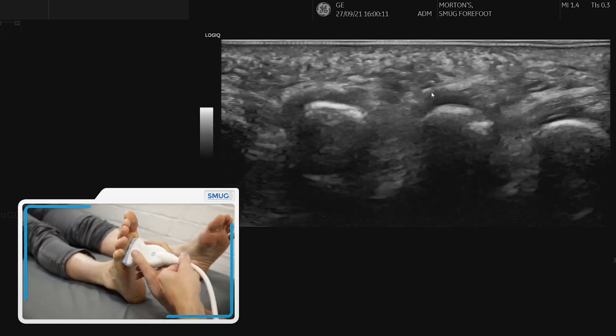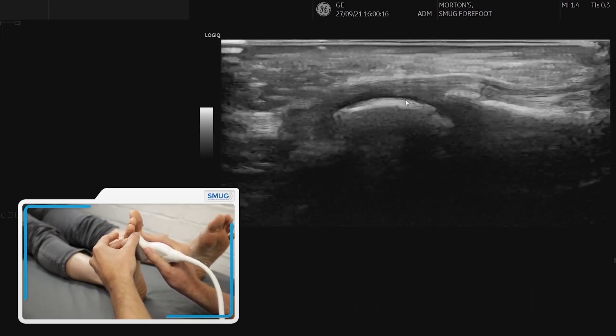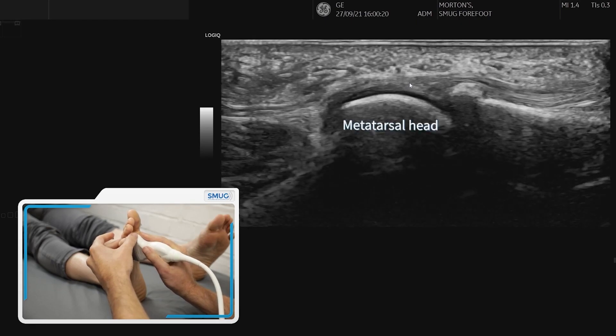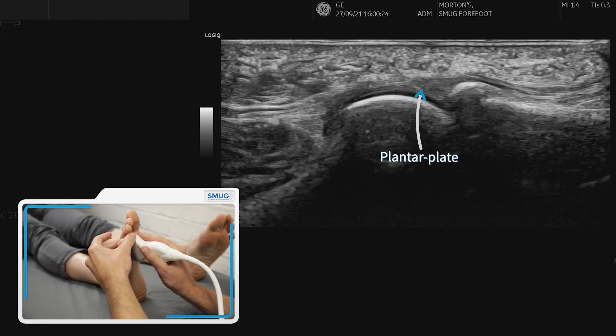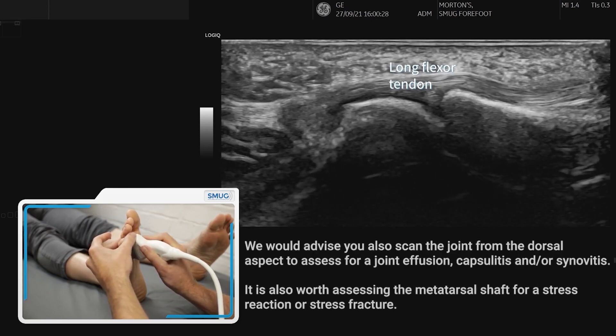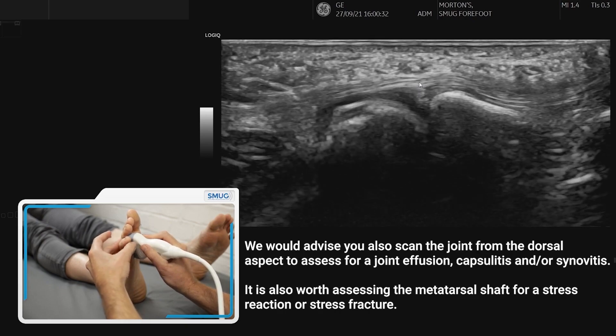We do need to have a look at this in long section as well, so if we go over the third metatarsal phalangeal joint we can see the plantar plate, the articular cartilage, and also over the top we can see the tendon. It's important to assess the joint because that is one of the differentials when you've got forefoot pain.